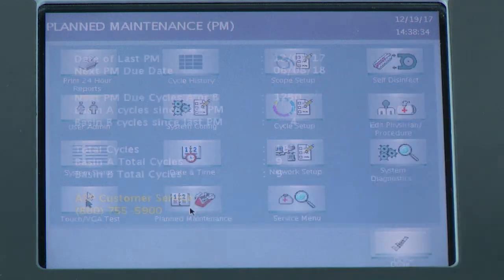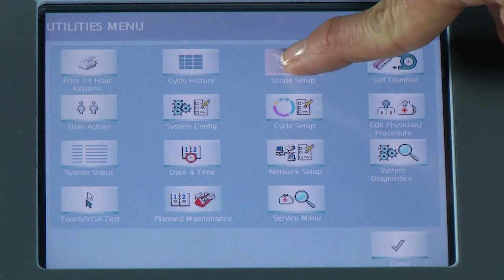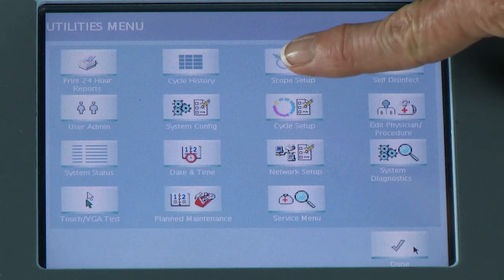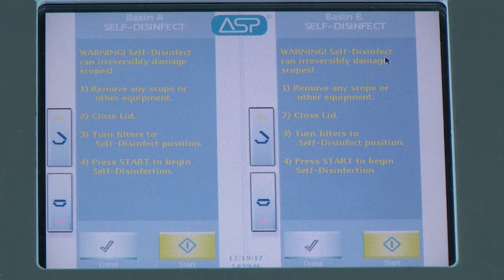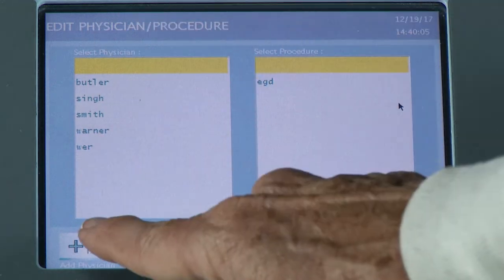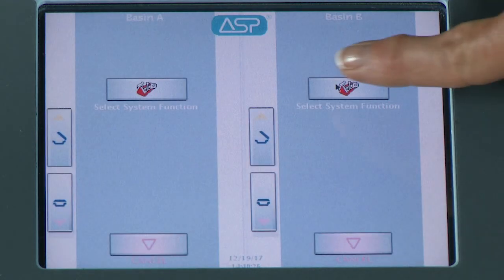Planned Maintenance displays your last maintenance and when maintenance is due next. Scope Setup allows you to add and delete scopes as necessary. Cycle Setup provides the login required to place scope type, patient identification, and physician performing procedure, the login required to remove a scope, and also allows changes at process time. Self-disinfect walks you through the steps to complete a self-disinfect cycle. Edit Physicians allows you to add and delete physicians and procedures. System Diagnostics provides troubleshooting messages.